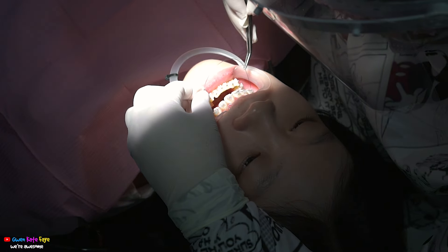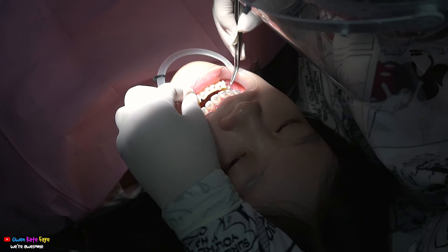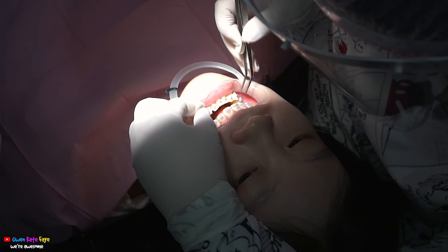Ta-da, this is the wires. We need to adjust the wire to the shape of my braces and the shape of my teeth.